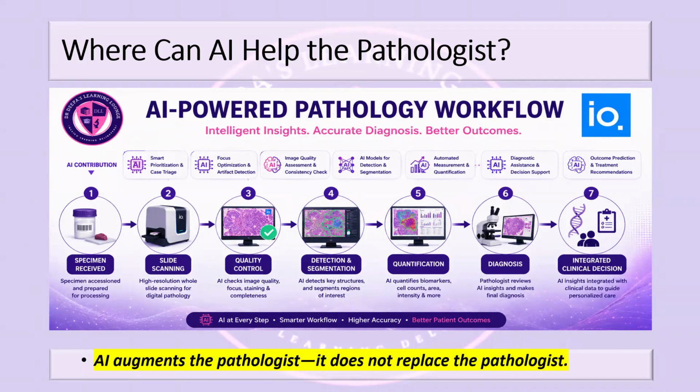One of the most mature clinical applications that AI does now, very important, is biomarker quantification. AI can produce a standard scoring system for immunohistochemical markers such as ER, PR, HER2, Ki67, and PD-L1, etc., so that you don't have to do that mechanically. It is already telling you the scoring. So your work is completely minimized. You just have to work on releasing the report after what it is telling you. Revalidate that and release the report.